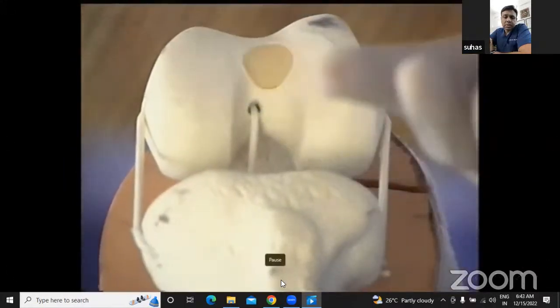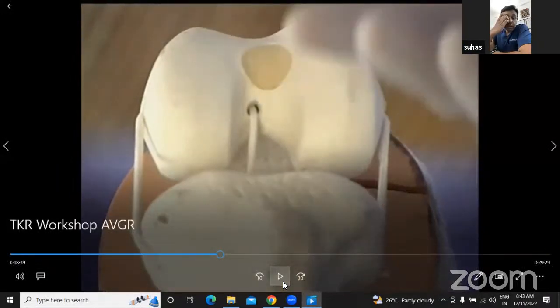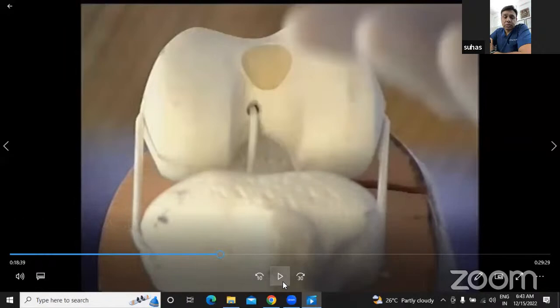Most beginner surgeons are worried about injuring the patellar tendon, so they underexpose the lateral side. The problem is whenever you're trying to size the tibia or do the tibial preparation and all the other steps, you have this tissue sitting right there and it throws you off. So it's important to understand the plane between the tendon as well as the tissue, and then expose the lateral side as much as you can right away, because that makes a world of difference in terms of exposure. Don't hesitate to clear up the lateral space.